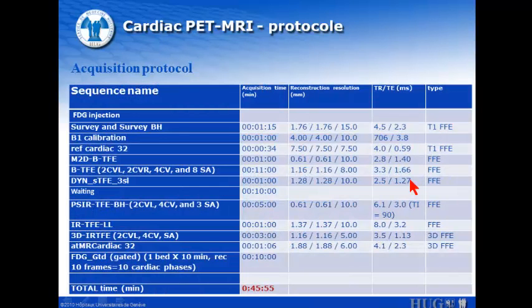Those are the precise MR series, MR sequences, what we did. There are also many sequences, and once again, there is a need for speed. I think there is some potential for improvement. When combining these two methods, do we really need all these sequences in order to give an answer?